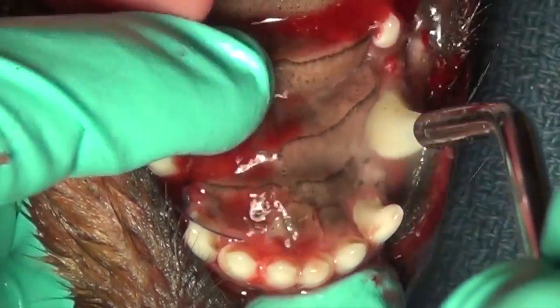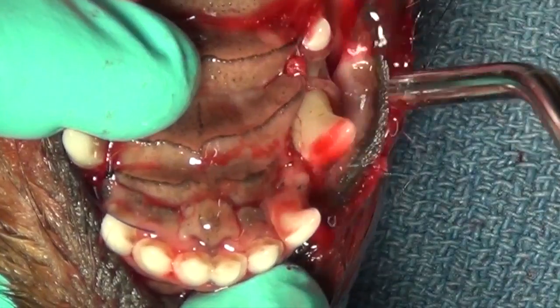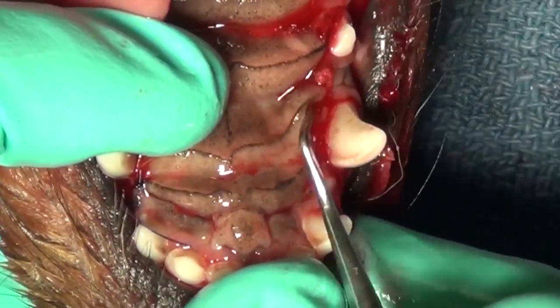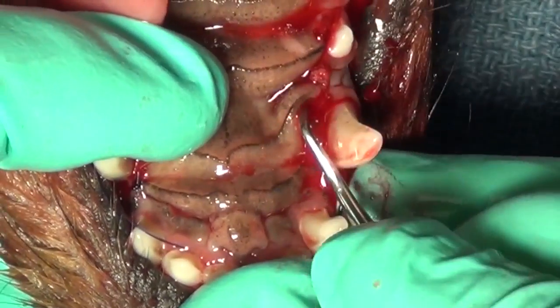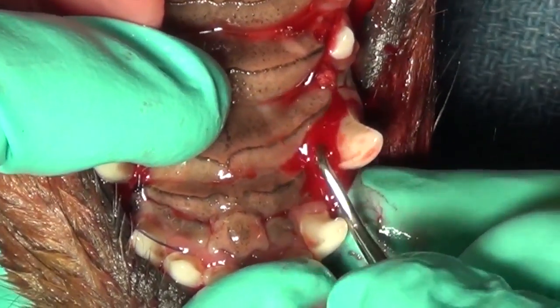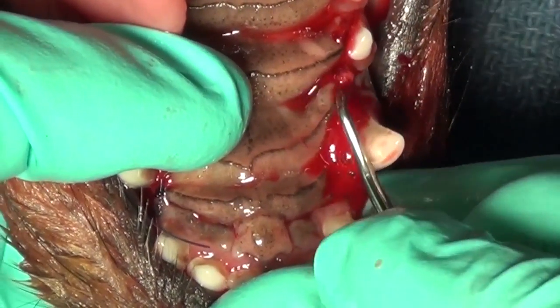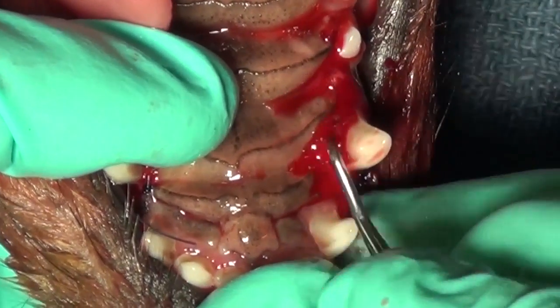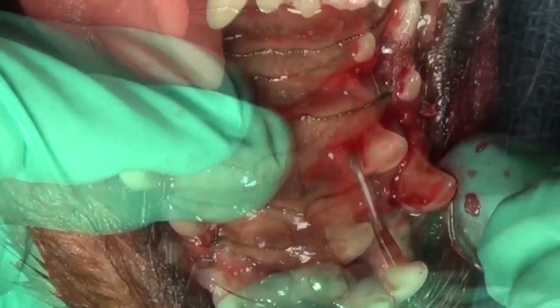These defects are deep but not very wide, so we don't need a huge access flap to get into that defect. This one's not deep enough where we even need to make incisions mesial and distal. We can see down into the depth of the defect, and if we can see down in and access with our instruments, we don't need to create that huge exposure.